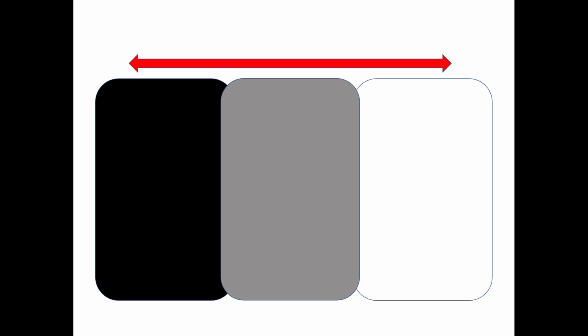We see things on the screen from anechoic to hyperechoic. So anechoic, no echoes. Think like anuric is no urine. It's transmitting all of the ultrasound, so stuff is traveling right through. It's not bouncing off anything, not reflecting off anything. This is blood. This is ascites fluid generally, or a pleural effusion. Any other liquid that's going to be in the heart is generally anechoic.